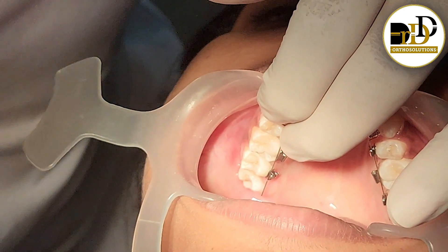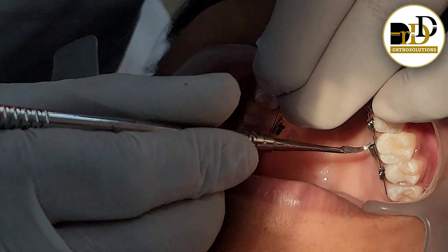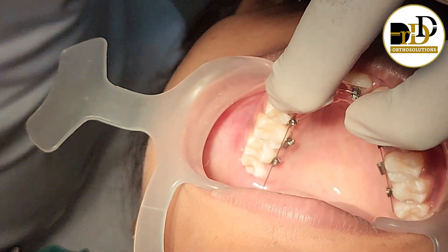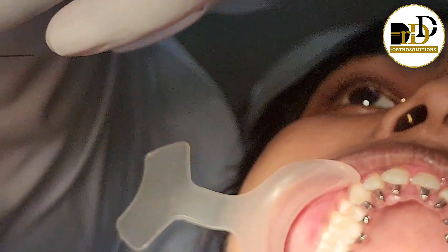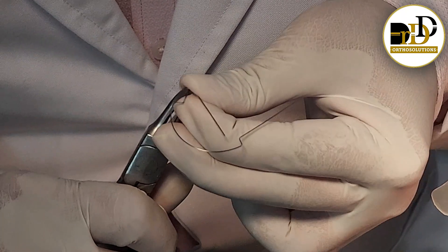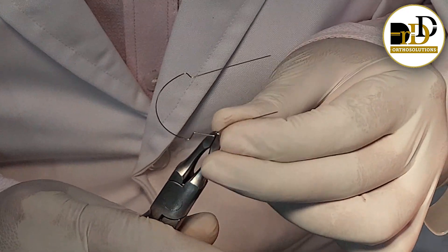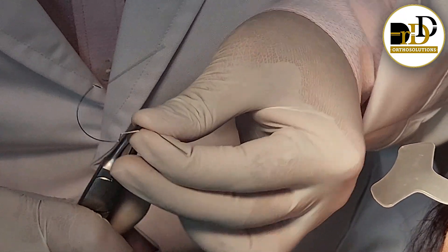Now we want to give a 2mm step bend at the molar region. We will be holding in the molar region and giving 2mm of step bend.